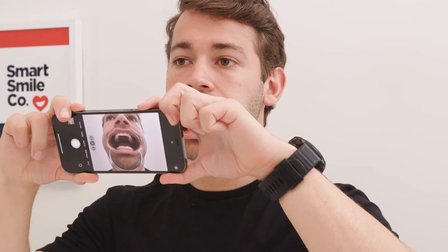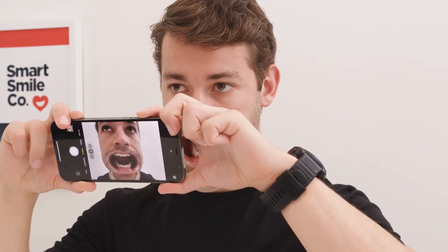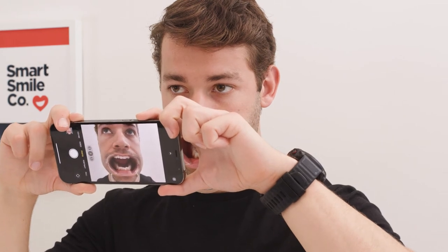While in front of a mirror, face the phone towards the mirror. Point your phone's main camera at your mouth and watch the reflection of your phone screen as you take your photos.